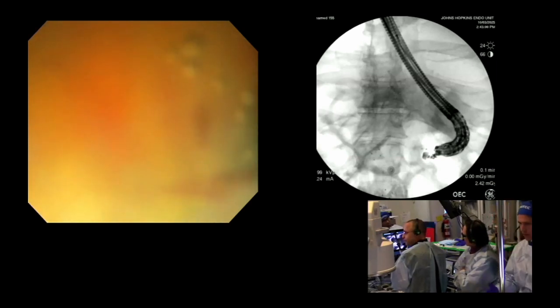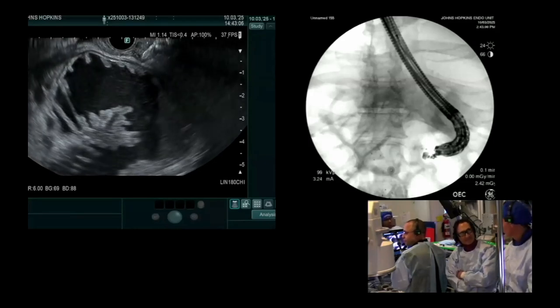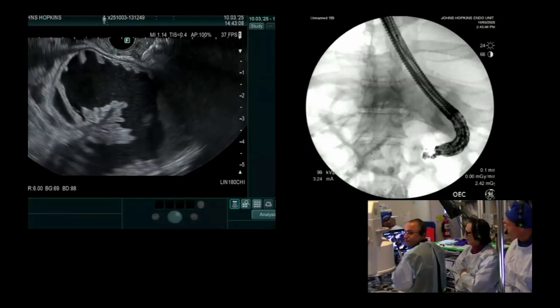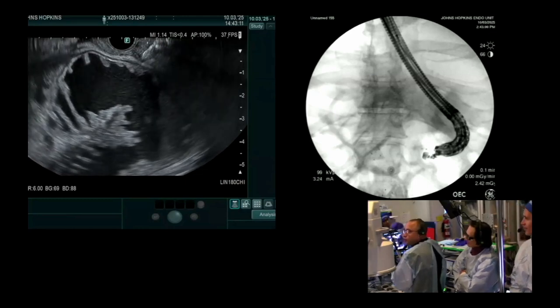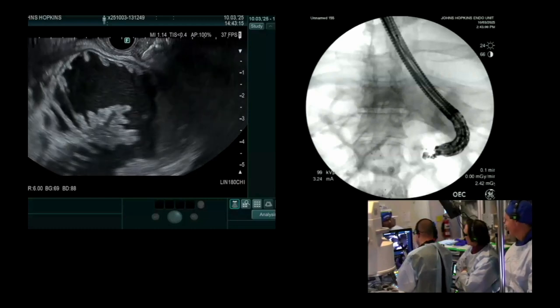So we had a lot of cases when we had to struggle after that to go to the anastomosis with the scope. So this is a very good position. Otherwise you have to make a 180-degree angle to get to the HJ, which is difficult.